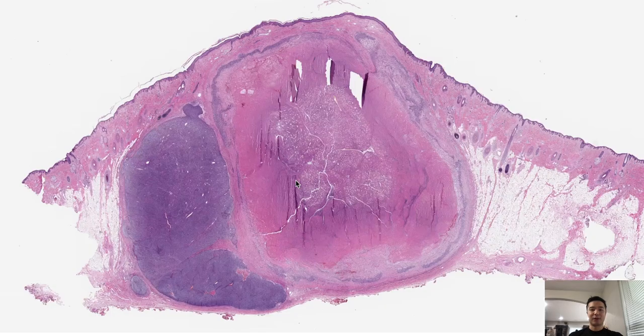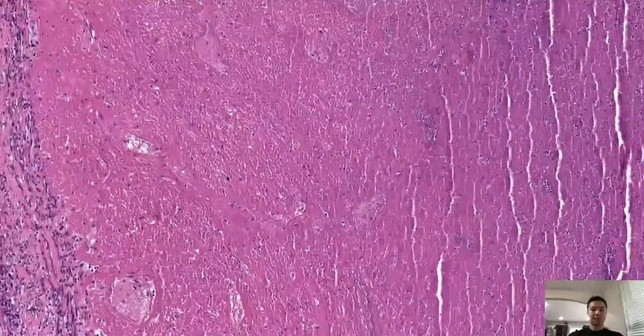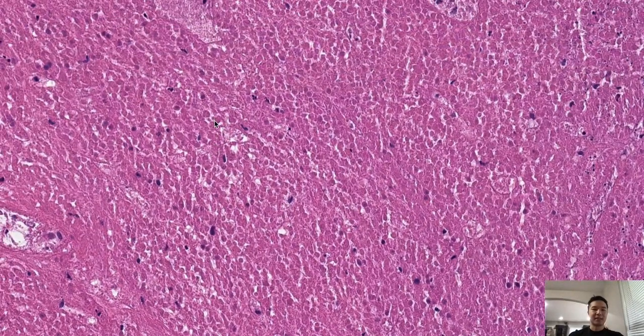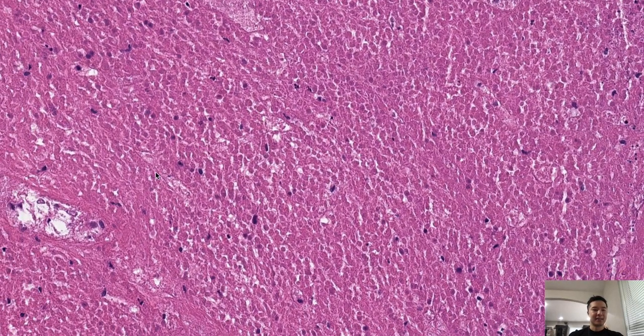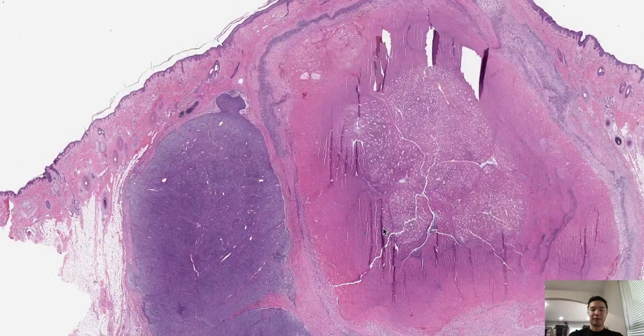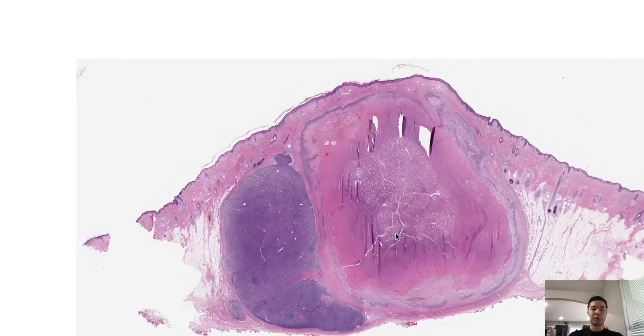But if we look closer, you can see it's necrotic because it's got the outlines of cells that have died. So that is necrosis. Another differential, and one that, if you call it and it's actually epithelioid sarcoma, can get you a lawsuit, is granuloma annulare.